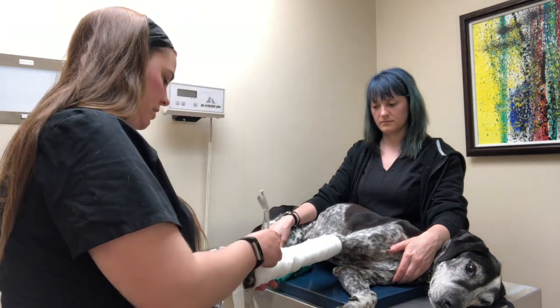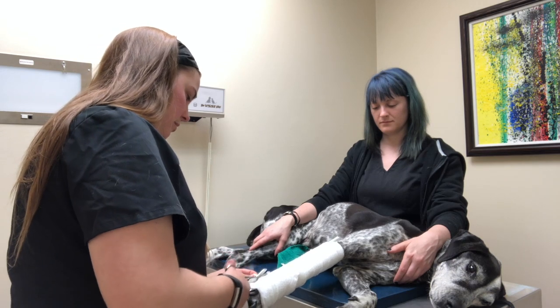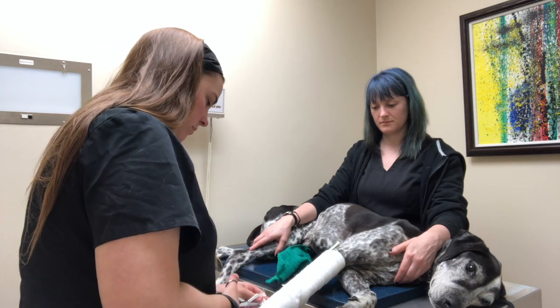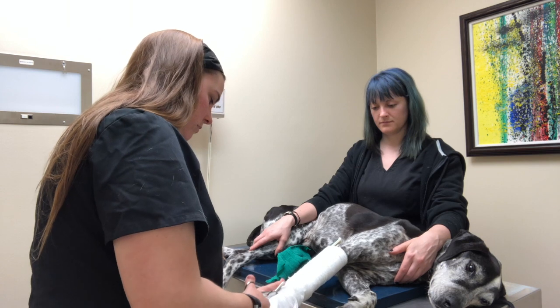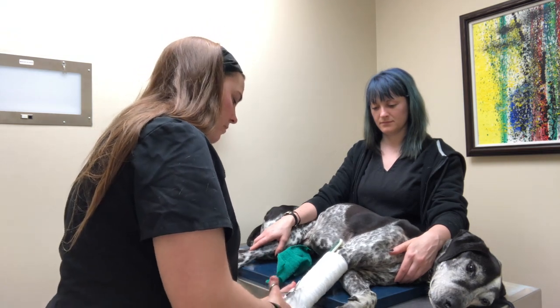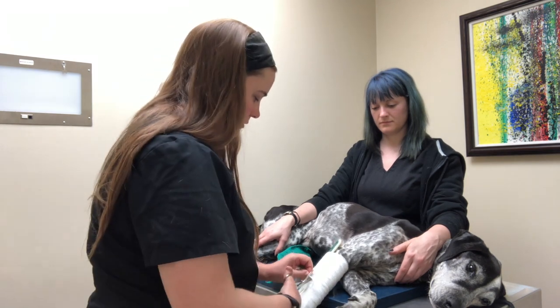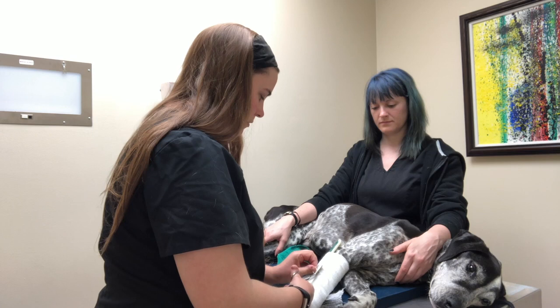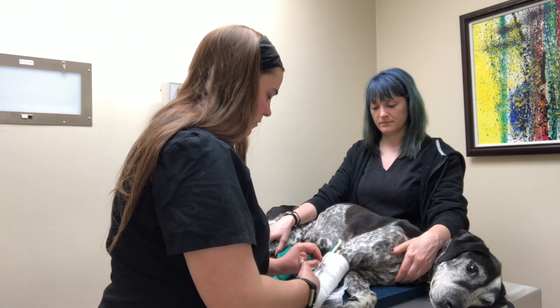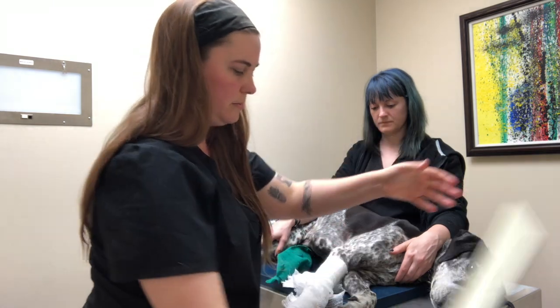Cut our gauze layer that's holding our splint in. Take out our splint.